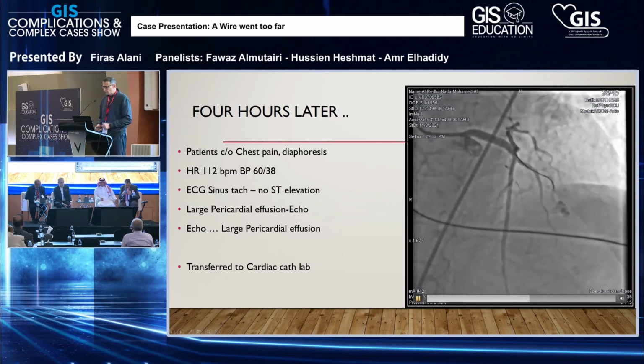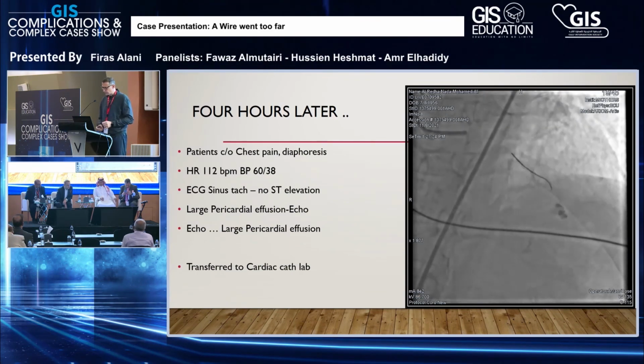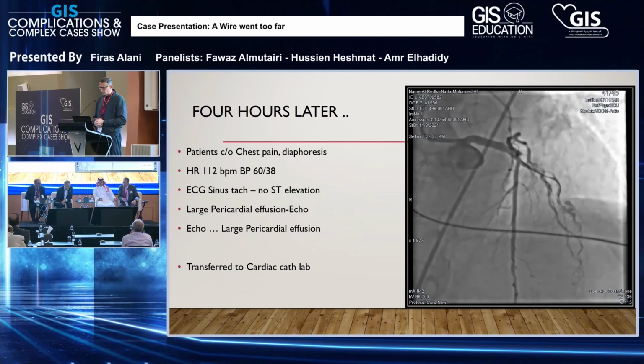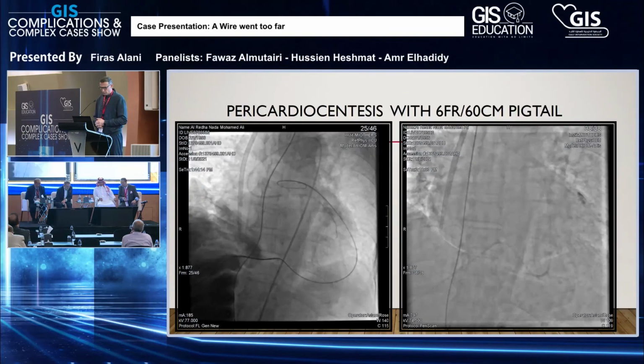Thank you. So you can see here now we knew what was going to happen, that there's a perforation, and this is a large perforation by virtue of having pericardial tamponade. It was difficult early on to decide which branch the perforation was coming from, and clearly it's from the diag, but whether it was a superior or inferior branch. The wire slipped through the struts of the stent in the diagonal into the diagonal superior branch. Next slide. And at this point, I went in and put the pigtail drain, and the patient became hemodynamically stable.